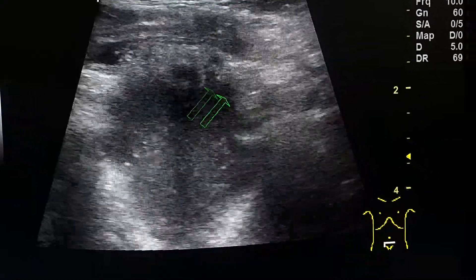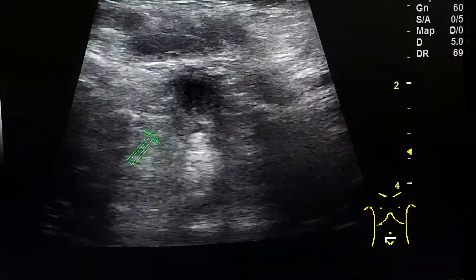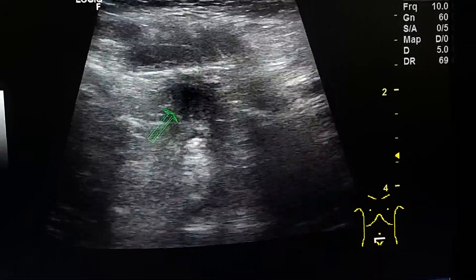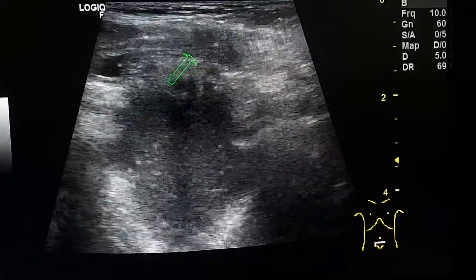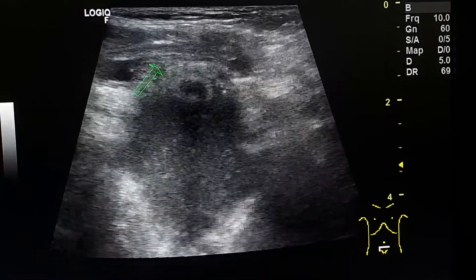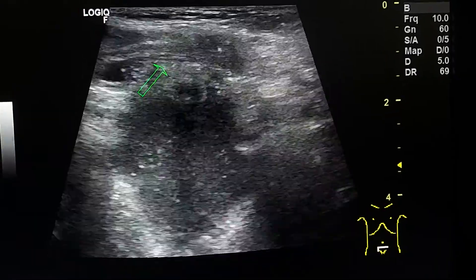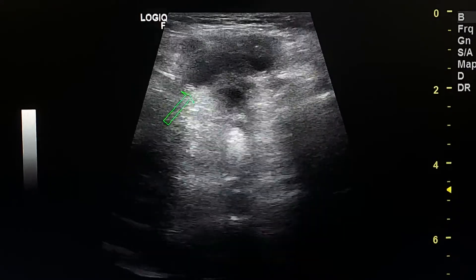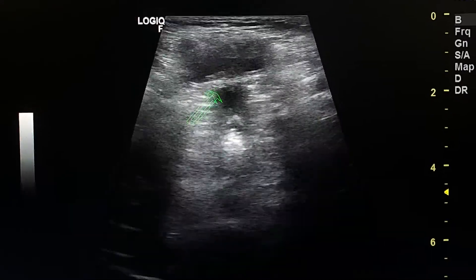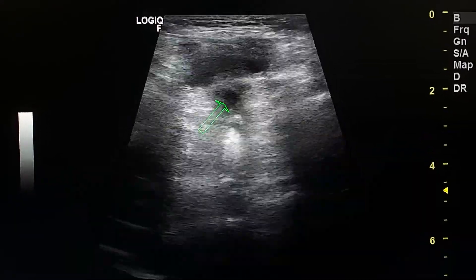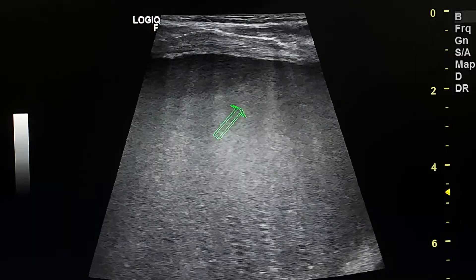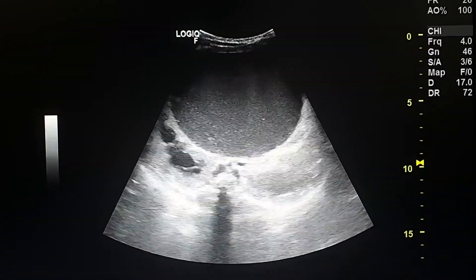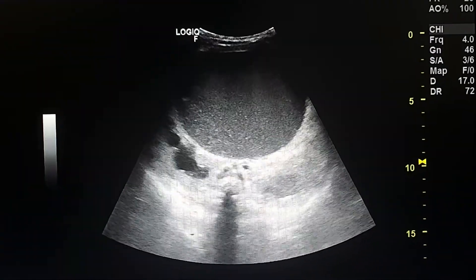This is a transverse suprapubic view. Here we can see the dilated vagina and the urinary bladder, which is nearly empty. By linear probe we can see a fluid-fluid level within the contents of this cystic structure.